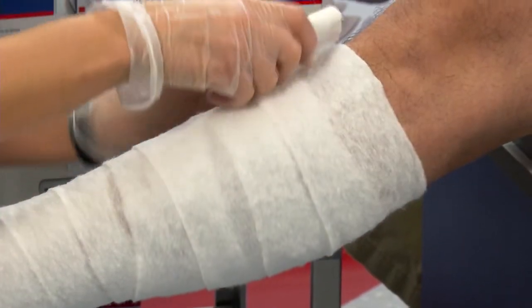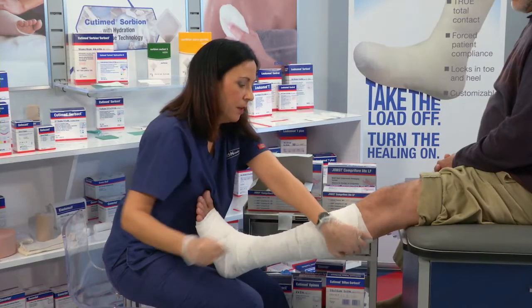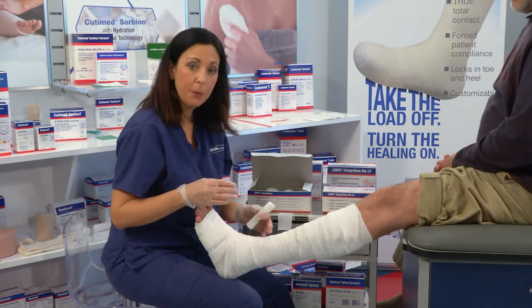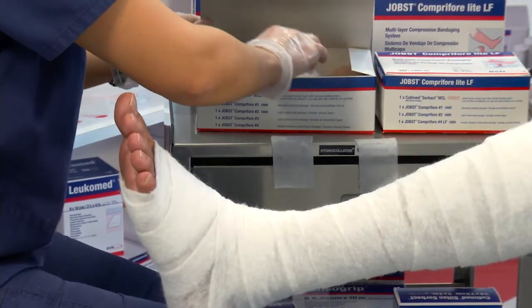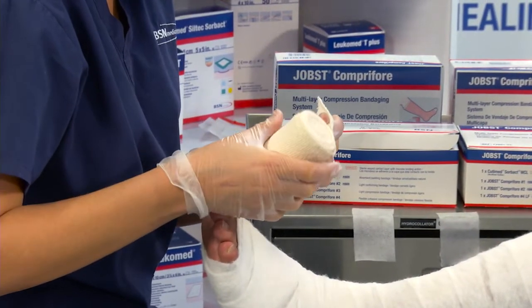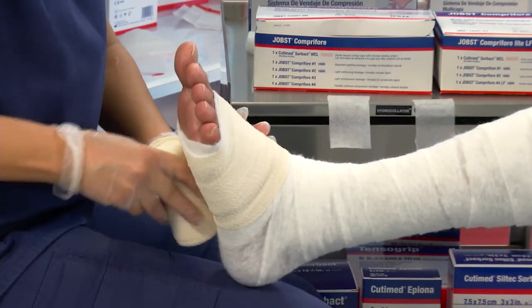We're going to stop at the tibial tuberosity, two finger breadths below the crease of the knee. This layer can be easily torn. You can use extra to pad bony prominences or build up the ankle circumference. Layer number two is a conforming bandage. This is used to smooth out layer number one.